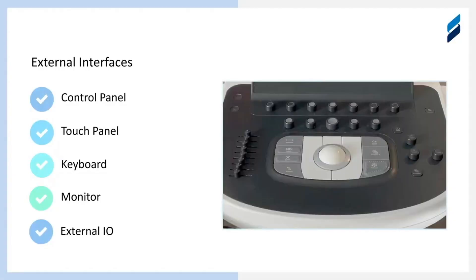Now we're moving on to the external interfaces system. We're going to cover the control panel and trackball, the touch panel — which is really the top portion of the control panel and just has a digital screen that is touch sensitive — the keyboard, the monitor, and the external I/O.